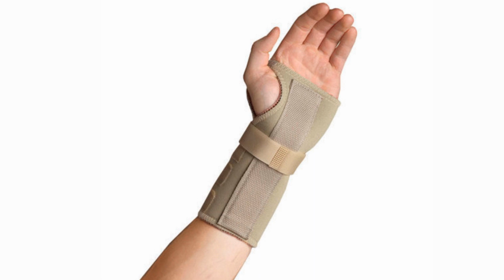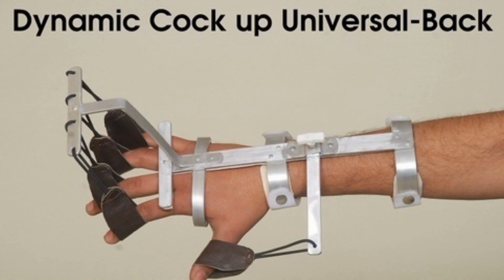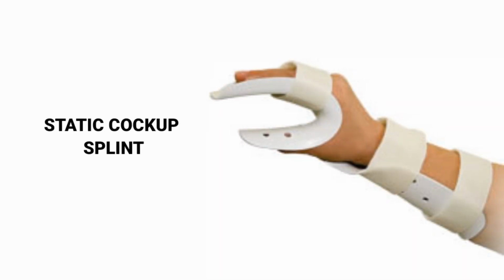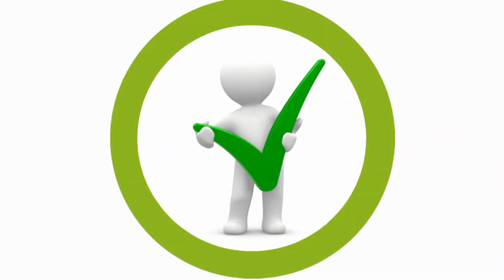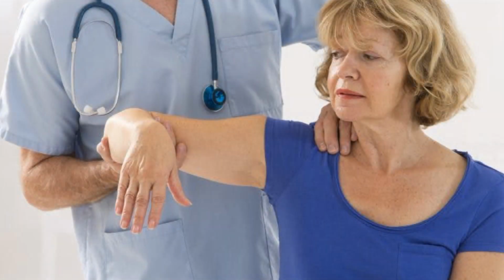There are two types of Cockup splint. The one is static Cockup splint, the other one is dynamic Cockup splint. Static Cockup splint. This name indicates it keeps the wrist and fingers in a static position. In this position, the wrist is extended, the metacarpals are semi-flexed and the fingers are almost straight. It is very useful in treating the contracture and tightness in the wrist flexor muscles. This is usually seen in paralysis cases like hemiplegia. The contracture and tightness are released by the static Cockup splint.